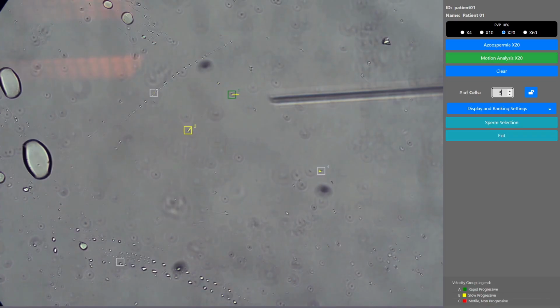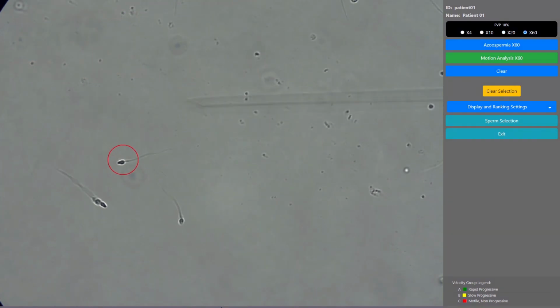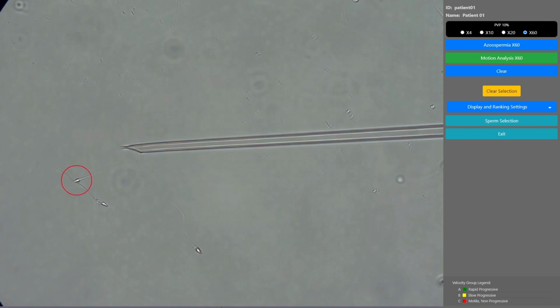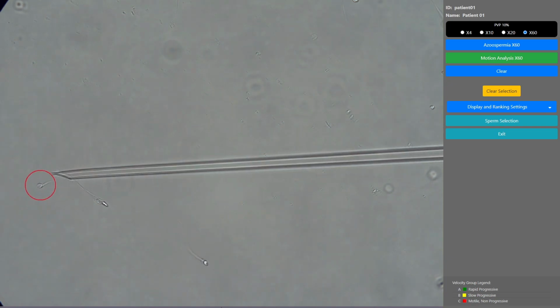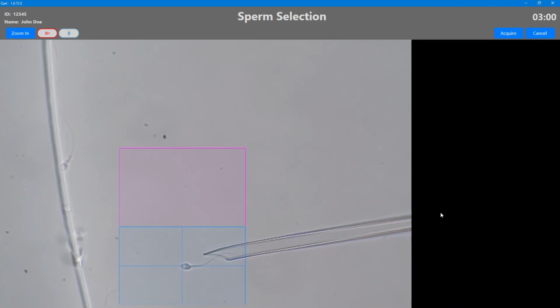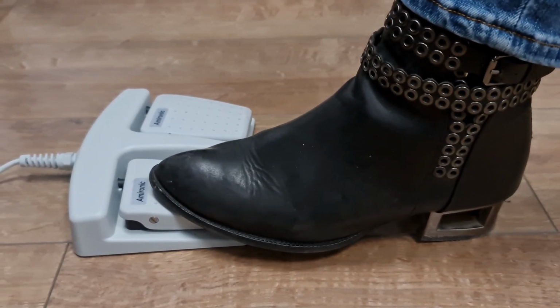The user may click on any tracked sperm cell to have the system individually track it with high fidelity until the user decides to select it for use or cancel tracking and return to examine other sperm cells. Once a cell is collected and placed in a clear area of the drop, the user may switch to holographic morphology analysis. Before imaging, the sperm is brought to and held in the imaging area, marked blue. When in place and in focus, imaging is initiated.